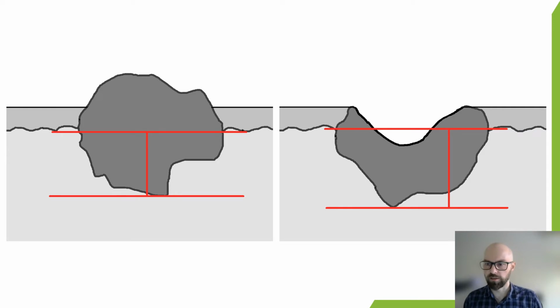So most of the cancer protocols and staging manuals use schematics like this, where you draw a horizontal line from normal mucosa across and then down. The issue is oral mucosa isn't dead straight. There's a lot of curved contours, there's a lot of lumps and bumps.